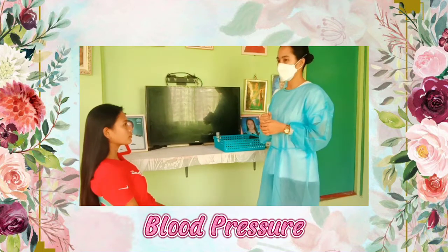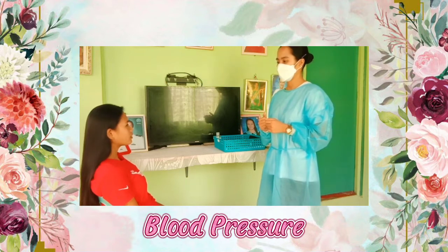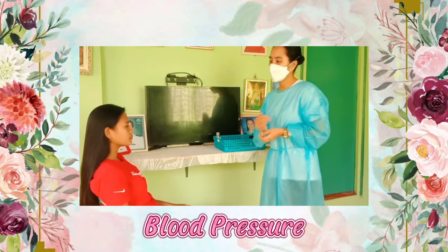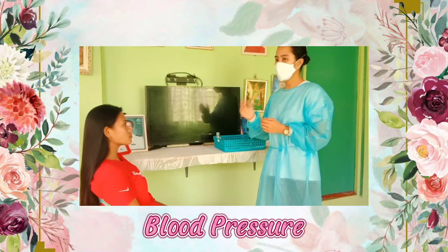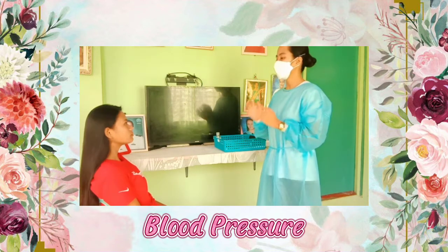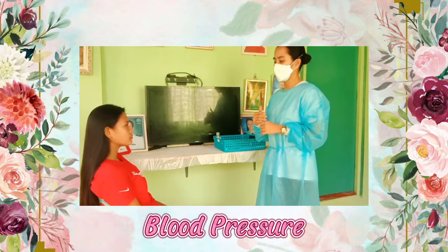So before we start, I have some questions for you. When was the last time you took your blood pressure? 2 months ago. What was your blood pressure back then? 110/90. Did you take any coffee or did you smoke 30 minutes before going here? No. That's good to know, ma'am. And now we're ready to assess your blood pressure.